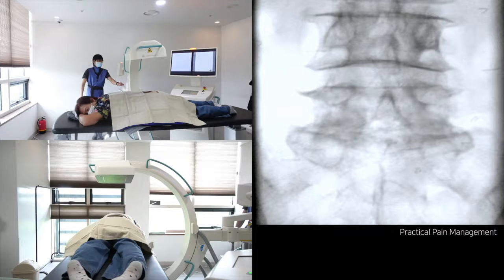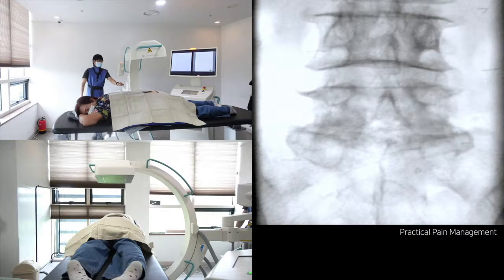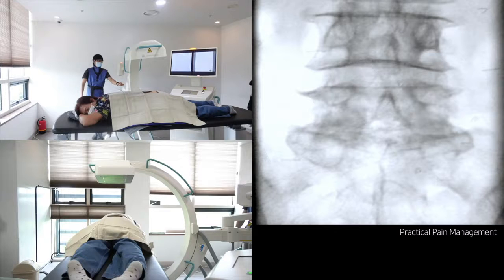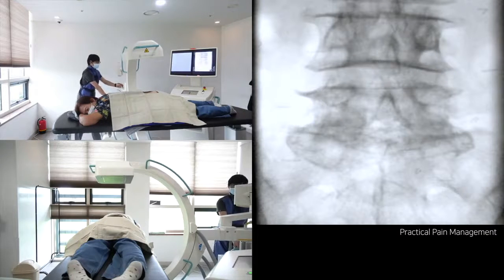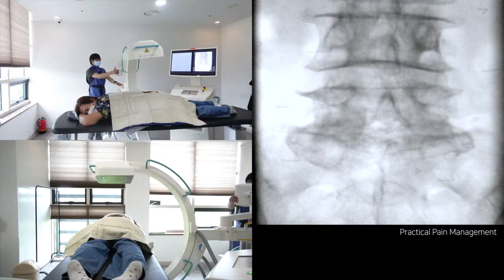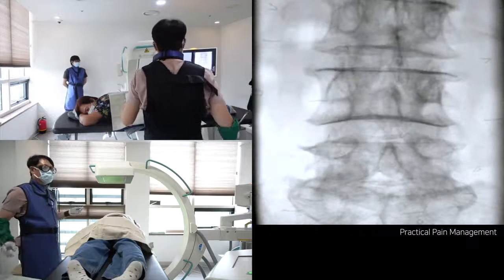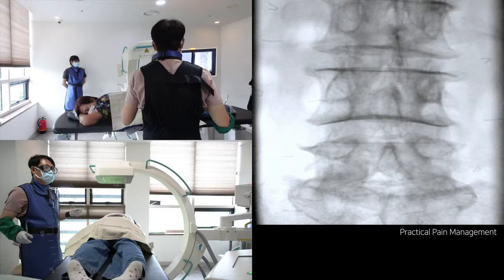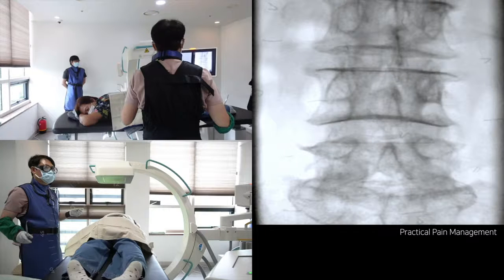You can also train your tech through the knowledge provided. Please check the cranial tilting and rotation angle in each procedure. I will show you a lumbar interlaminar epidural injection via the L45 midline approach. The L5 spinous process is placed in the screen center. The object of the radiation tech is to provide the optimal image for the procedure and protect your hand from radiation. There is a transitional vertebra in the S1, and I will introduce the needle at the L45 segment. In this view, I must put my hand in the radiation field, so my hands are in danger.